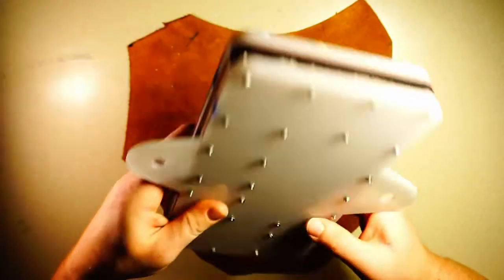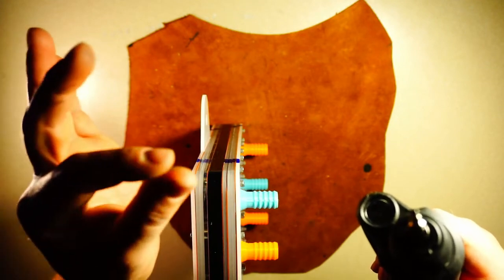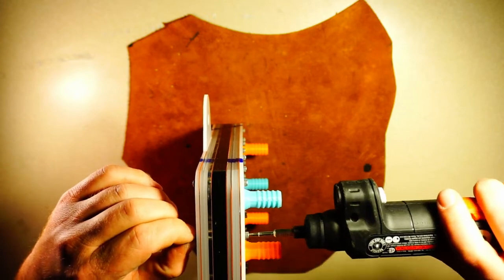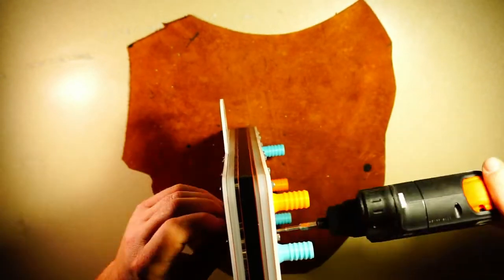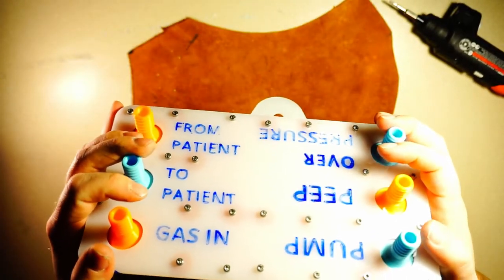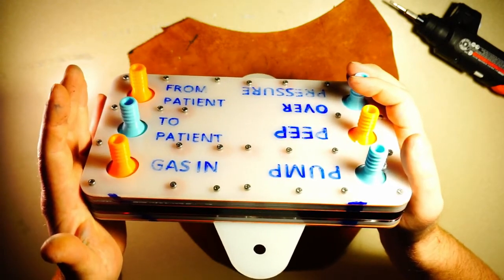Okay, so once you have all of the nuts and bolts on loosely, you're going to want to just tighten them all up. I like to use an electric screwdriver, but only use my fingers on the back side so that I can't over tighten these. There you have it, a completed valve block. You can take it apart and sterilize it pretty easily and reassemble it in a matter of minutes. Now let's go strap it to the machine and see it in action.